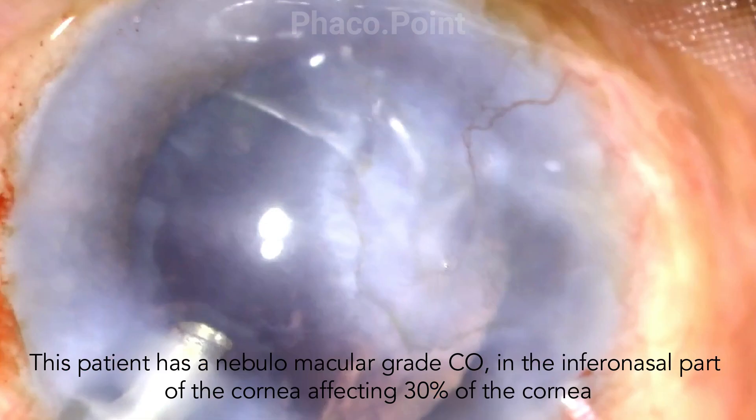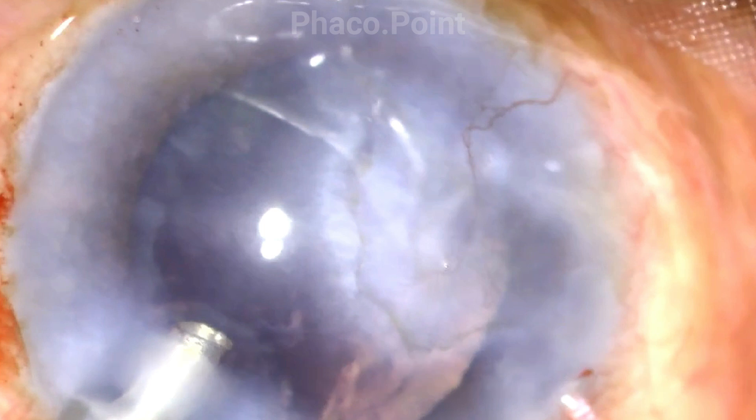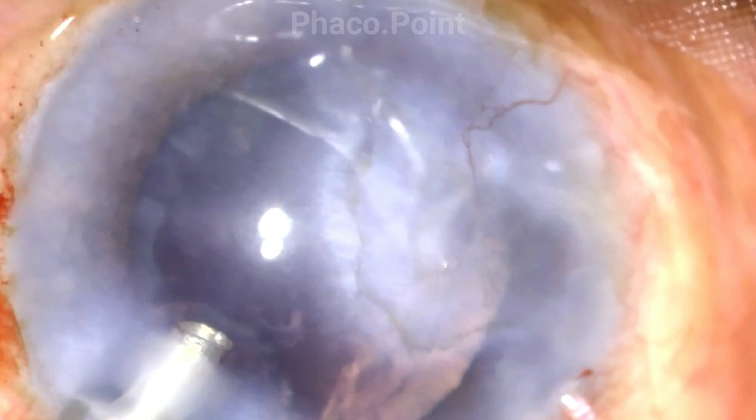Visualizing the same corneal opacity once the cataract is out under high magnification, you can actually see that there is a significant corneal opacity involving the nasal half of the pupil and the associated nasal cornea. Let's now get to the video tutorial of the surgery.